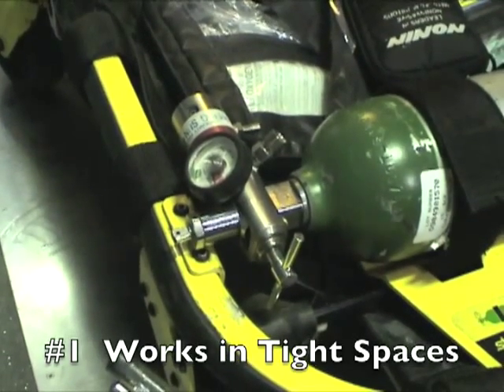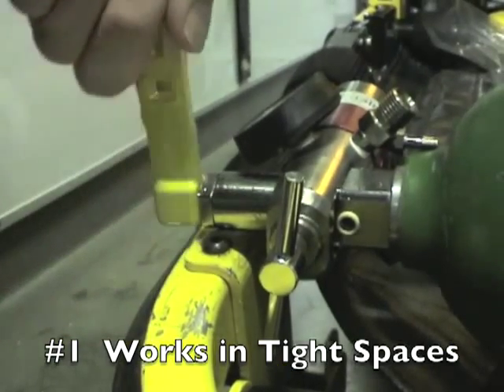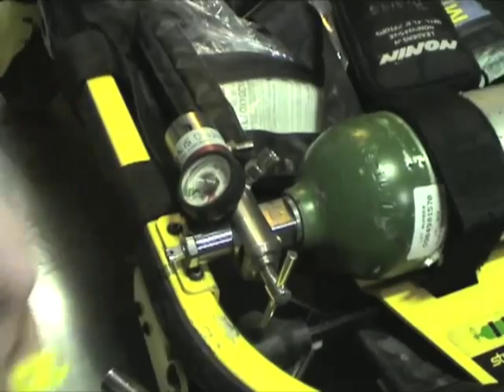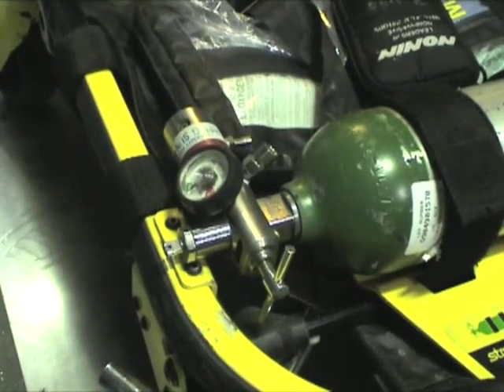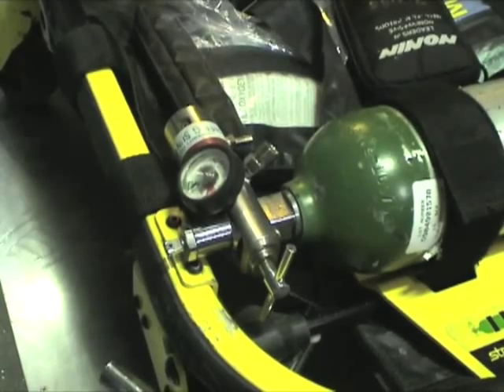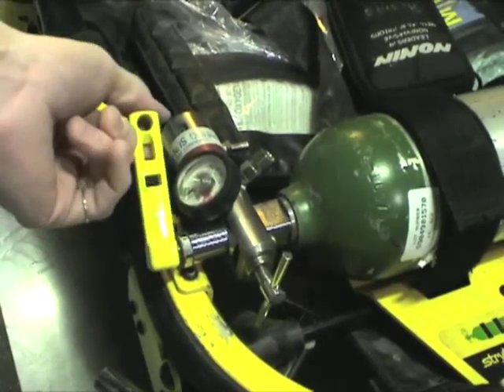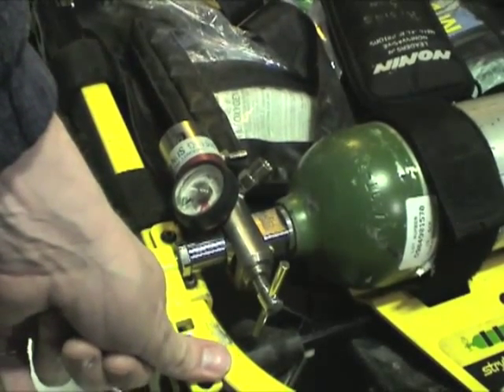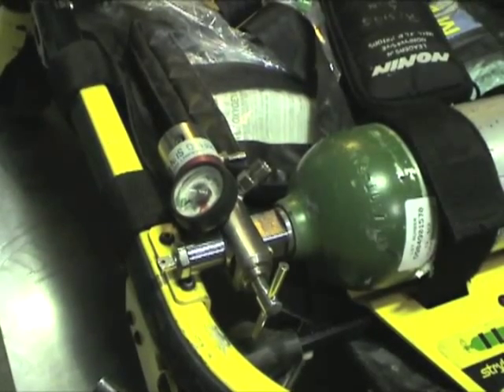Let's talk about reason number one: it works in tight spaces. We have stuff in bags, we have stuff attached to our equipment, and you need a wrench that's going to reach in there and attach and work quickly and easily to turn on your oxygen bottles. This EMS oxygen wrench does that — turn them on, turn them off — it's quick and easy, and it gives you the leverage and purchase points you need to get the job done, even on tightly stuck valves.